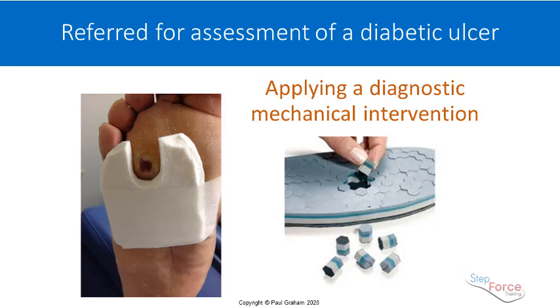So we can put on a felt pad like you've seen there, or another different design, review it and look at the peak pressure and actually look at the numbers, going to the numerical listing and saying, okay, is this much less? Are we getting under 2 kilograms per centimetre squared? And then go to the integral pressure and see if we can share the weight bearing.